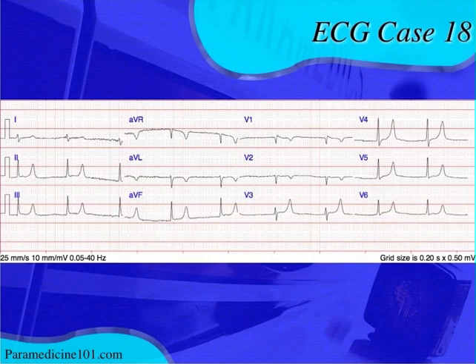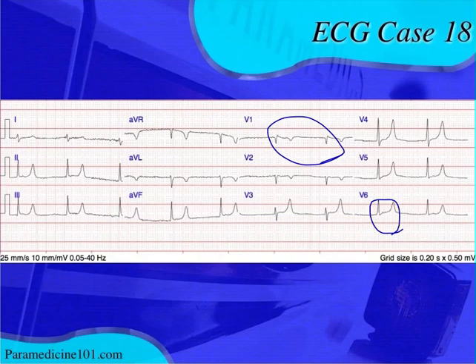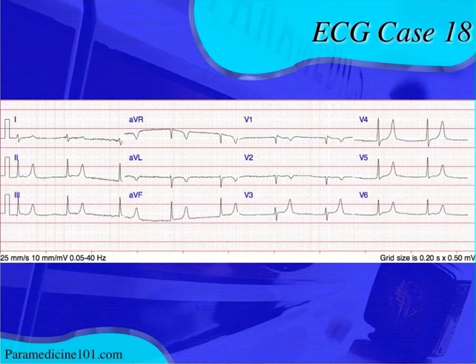Looking at the precordial leads, you should see a mostly negative QRS in V1 transitioning to a mostly positive QRS in V6. That does happen here — V2 is mostly negative, V4 is mostly positive — so there is a normal precordial transition. Moving along to intervals: the QRS is narrow. The QT interval may look prolonged, but it's a slower rhythm. If you correct it with Bazett's formula, or look at the QTc on the 12-lead printout, you'd see it's a normal QT interval. The PR interval — we already talked about it — it's a junctional rhythm.